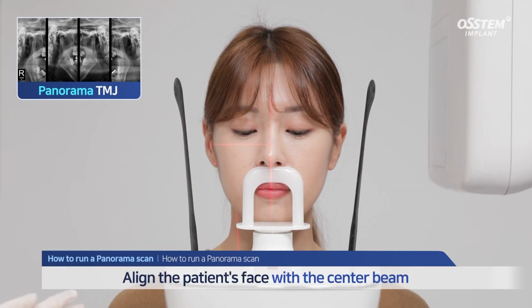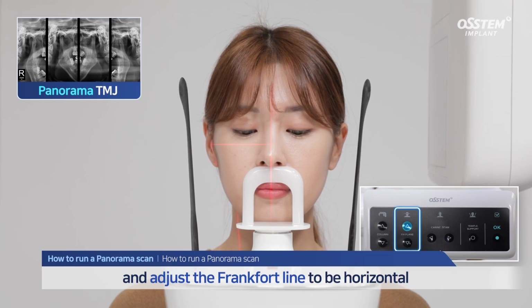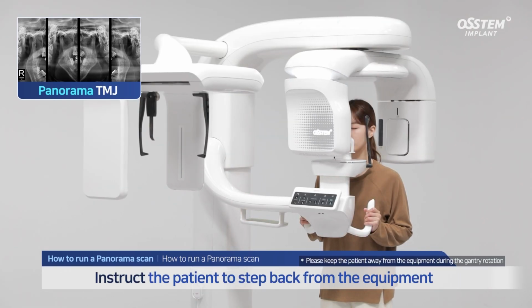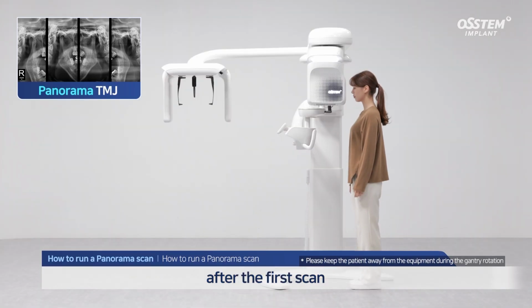Align the patient's face with the center beam. Ensure that the Frankfort line is horizontal. With the patient's head fixated and the mouth closed, start the first scan. Complete the first rotation of scanning with the mouth closed and have the patient step back from the equipment.